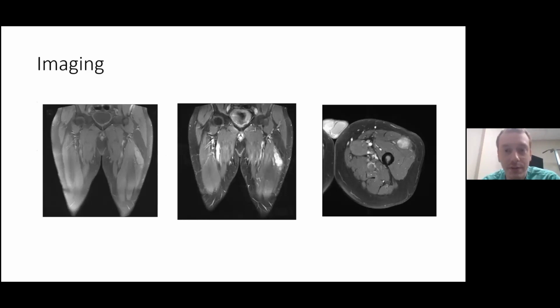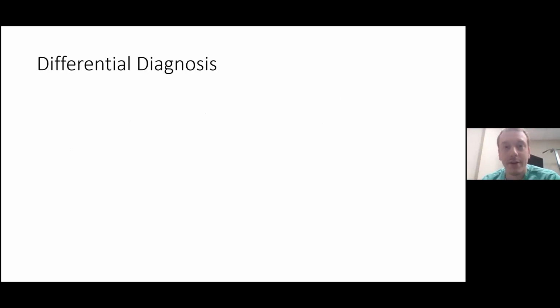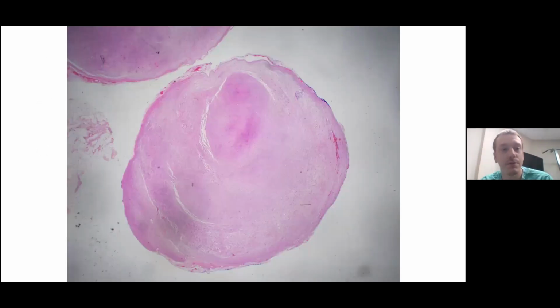Let me put the images. Lateral femoral cutaneous nerve, maybe. Not a bad thought. I mean, it's definitely not a major motor sensory nerve, given its superficial location. It looks like it's located in one of the quadriceps muscles superficially. So I suspect it's sensory. I don't think it's actually lateral femoral cutaneous, because those are typically in the subcutaneous tissue, and this is kind of partially embedded in the muscle. But I suspect it's a distal branch of the femoral nerve. Yeah, that's right. Very good. Perfect. Okay, let's go to pathology then.